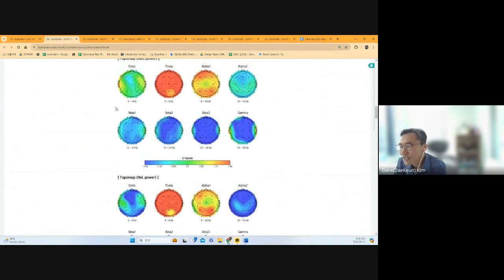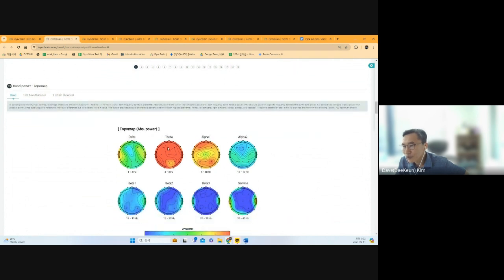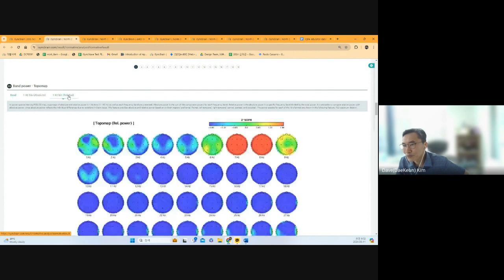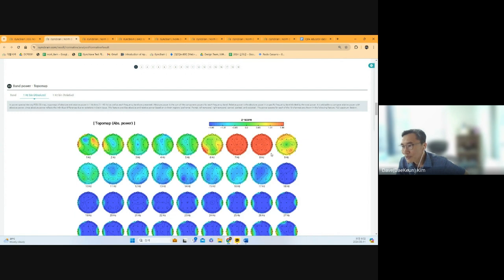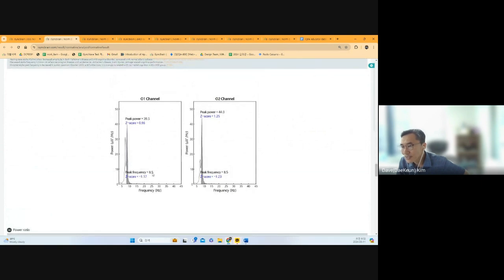And usually we, I think there is only 10 minutes left. I think we need to review the depression cases in another meeting, and we can prescribe the photobiomodulation in this case. For example, the alpha frequency is a little bit slowing here, 8.5. So we need to speed up the alpha frequency. It is a kind of brain brightening protocol in the neurofeedback.